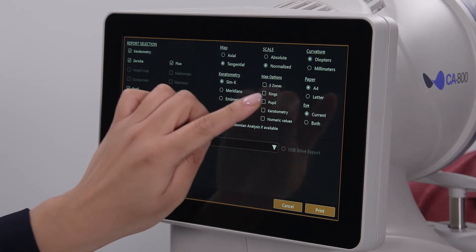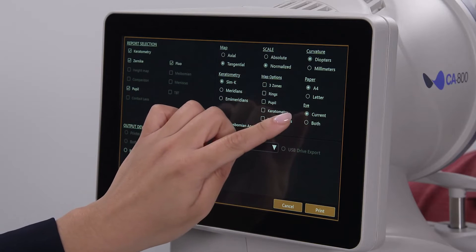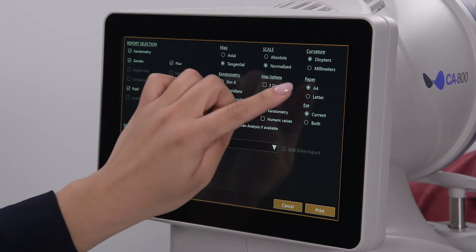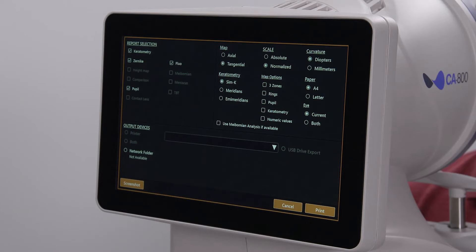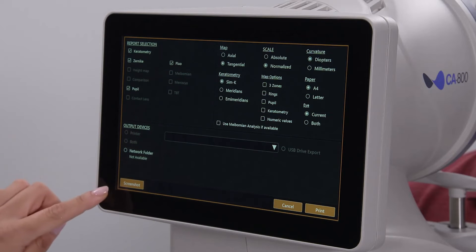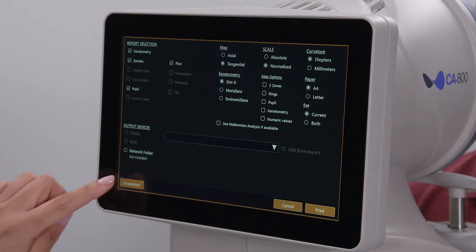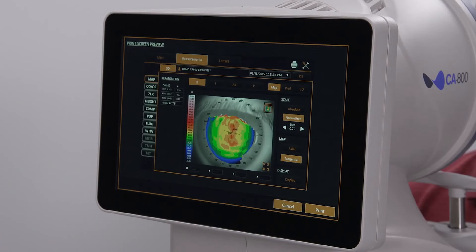You can select a report for one or both eyes, along with the paper format. Alternatively, you can simply select screenshot at the lower left, and the printout or exported image will be exactly what was shown on the screen before you selected print.